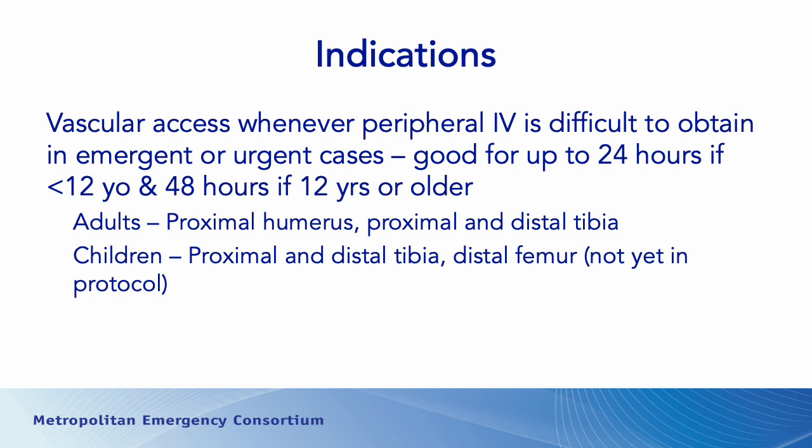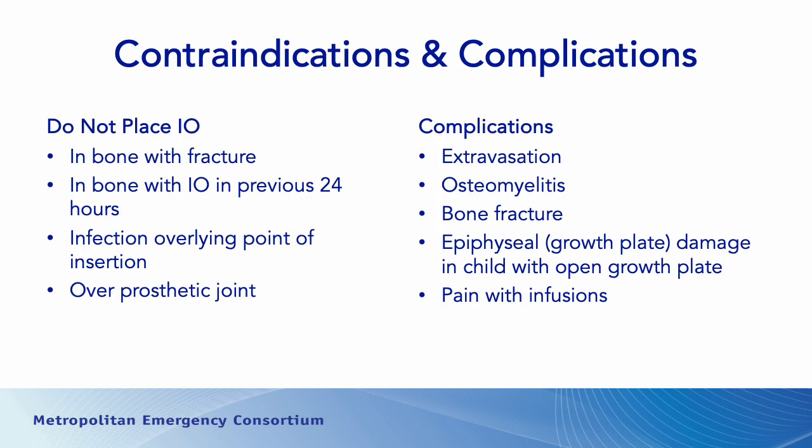Nothing really much officially out there yet, and the EZ-IO people say they can't promote that because it's not been FDA approved yet for use in the distal femur of adults. How about complications and contraindications?